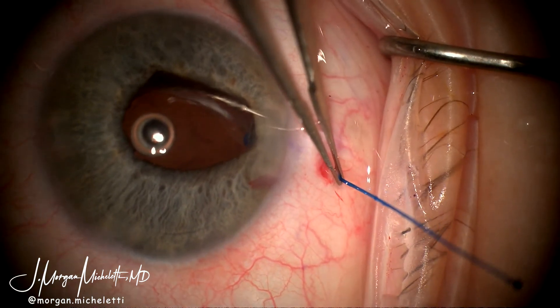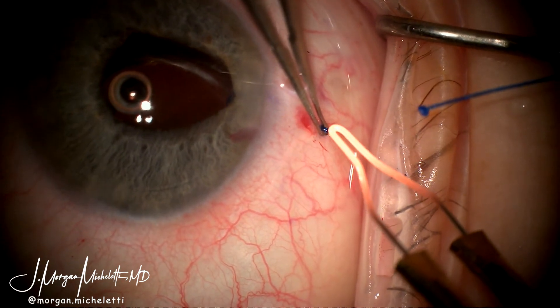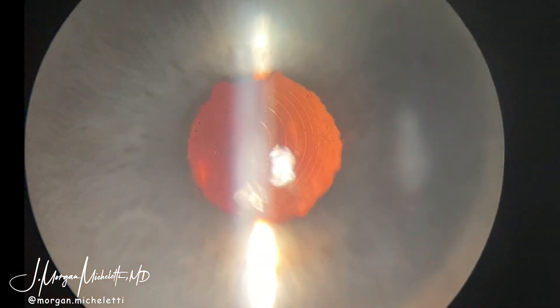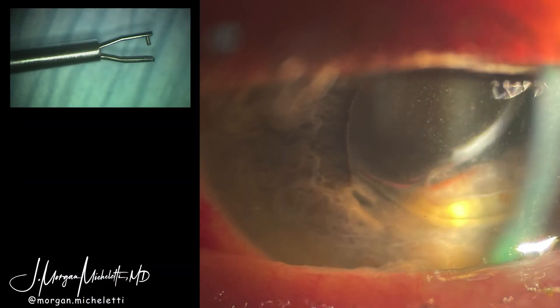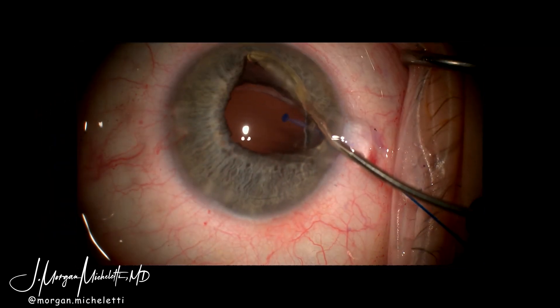The lens was then positioned and the final flange was created using cautery. The flange will disappear under the conjunctiva as demonstrated in other techniques. Miochol was then given to constrict the pupil and a 10-0 nylon was placed and rotated into position. At post-op day one, vision was 20/40 and the lens was pretty well centered. Utilizing this intraocular punch with a flange technique, this patient was able to avoid explantation of a multifocal lens and achieve finer precision with fewer scleral passes than throwing a suture around the haptic.